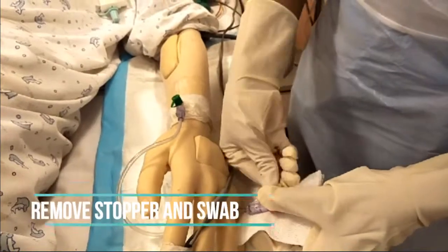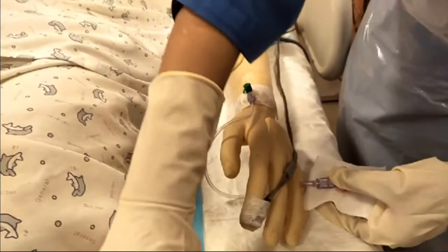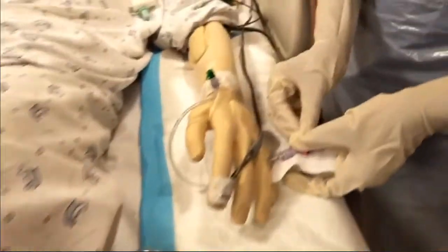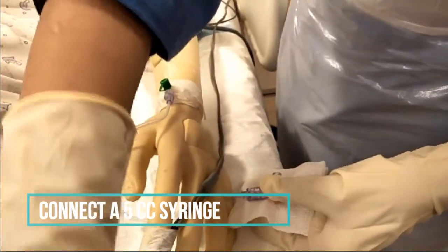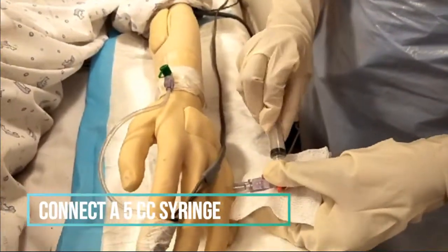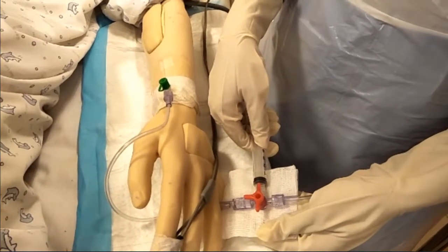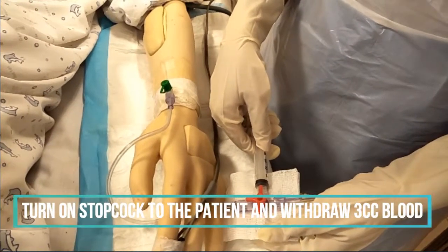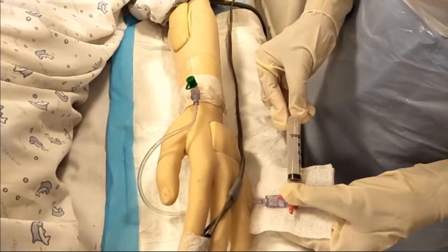Remove the stopper and then swab. Connect 5 cc syringe. Turn on stopcock to the patient and withdraw the blood from the arterial line, approximately 3 cc.